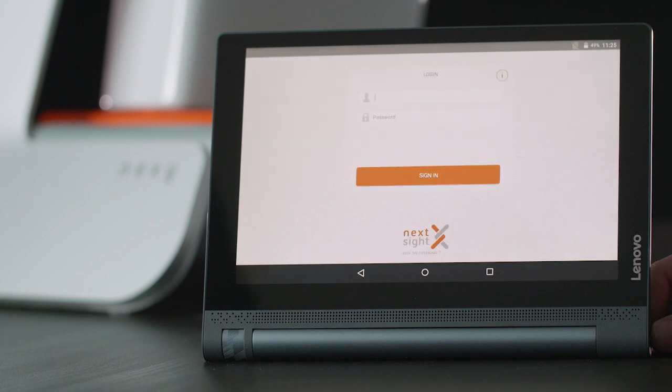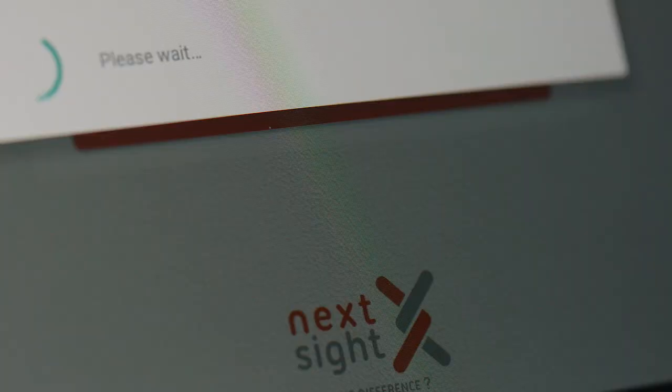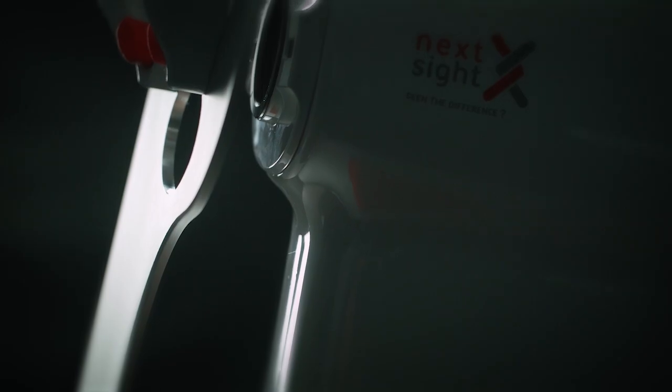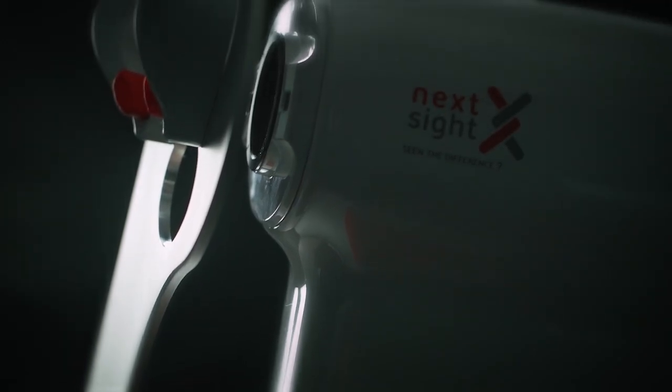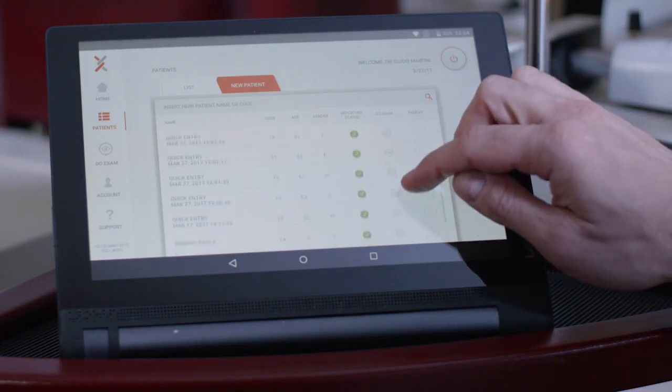To access the Nexi service, you simply need to enter the unique secret access credentials provided by Nexi. These allow secure data encryption across the Nexi service, ensuring that personal data remains safe and completely private.